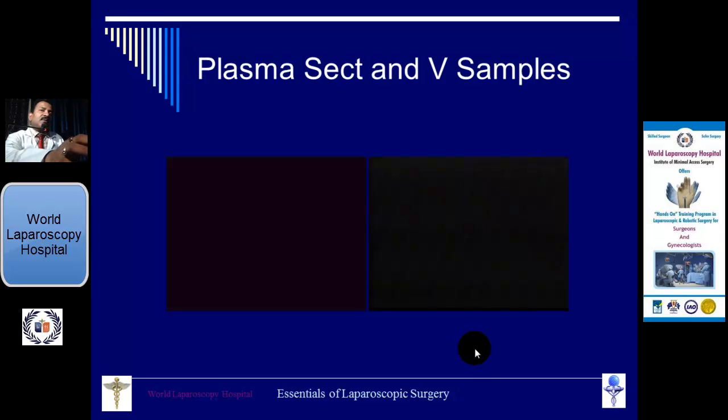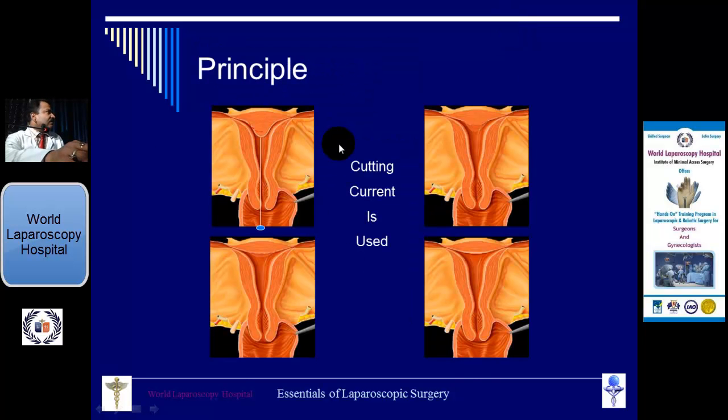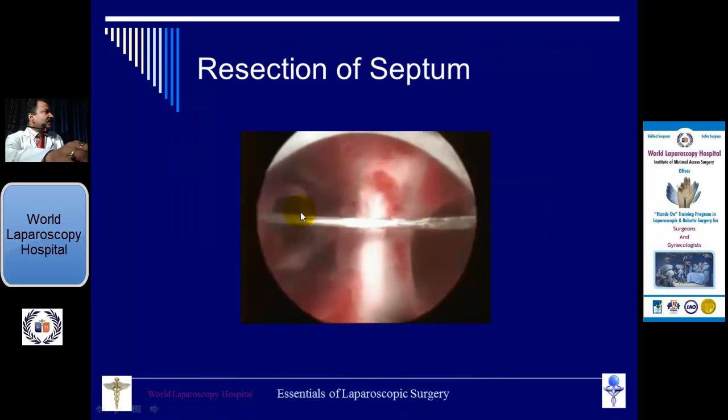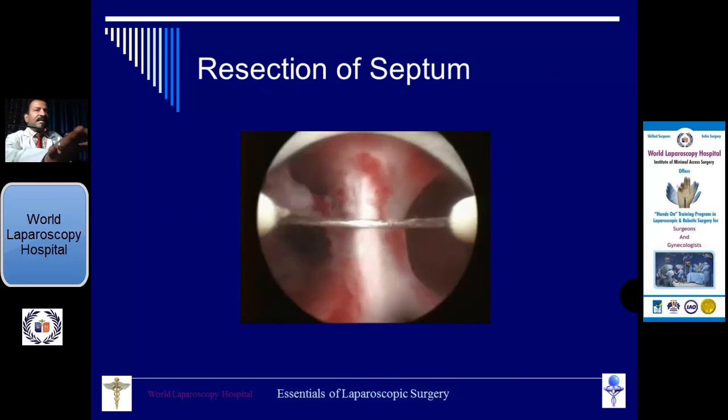There is no problem of hyponatremia. Sometimes you have a septate uterus. In those situations you will do the probing, and then you will see the whitish band there in the middle. A white band-like structure will be visible, and then you can do the metroplasty. You just have to split it in the middle.